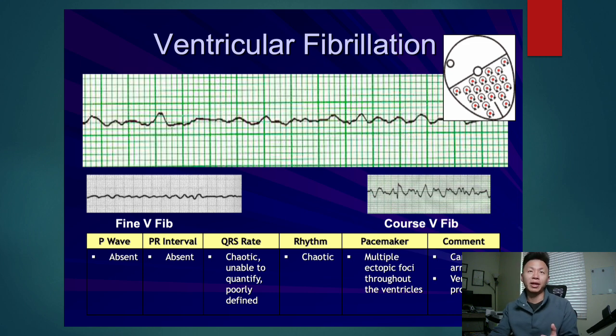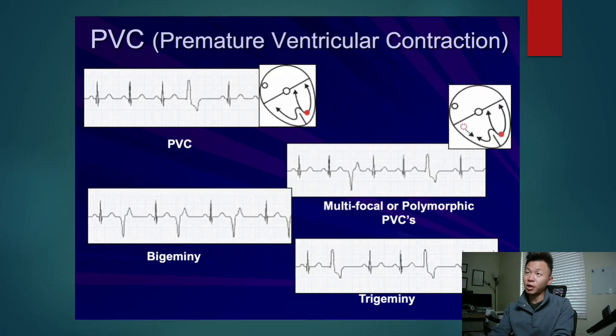Another easy way to remember that is VFib, defib. For ventricular fibrillation, we defibrillate. Defibrillation, the key word there, defibrillate. So no discernible rhythm here. This patient is going to be pulseless. We will have to do CPR, and the ultimate fix again is going to be that defibrillation. All right. These are called PVCs, just the ventricular rhythm, ventricular beat, right in between two different PQRST waves.